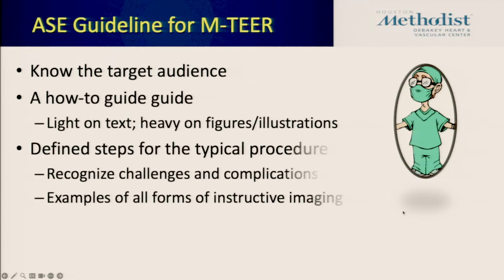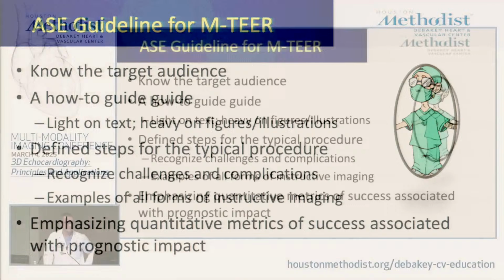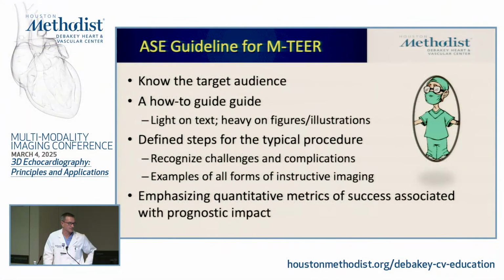So that's just kind of a quick summary of the new guideline and what's in the works and how we incorporate 3D in real practice. Questions or comments about 3D echo and what's happening today versus what was happening 5 years ago?